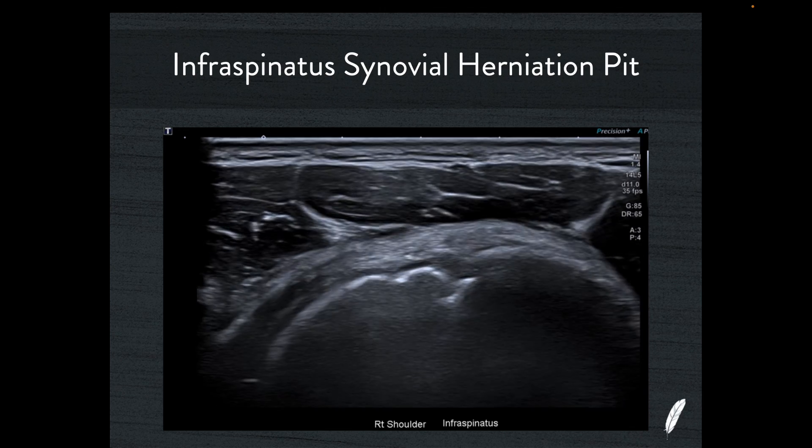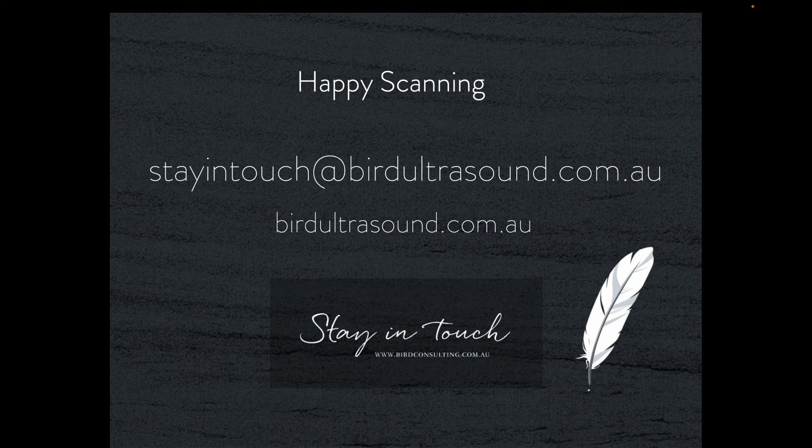It's nothing to be concerned about. I hope you now feel confident that you can tell the difference between a synovial herniation pit and a partial thickness articular surface tear of any of these rotator cuff tendons. It is a great piece of knowledge to have to prevent the classic MSK ultrasound mistake of making a false positive diagnosis in a patient that simply has a normal anatomical synovial herniation pit. If you're interested in a more detailed look at all the other little chinks in the bone — from erosions from gout, rheumatoid, osteoarthritis changes, enthesopathic changes, etc. — please visit birdultrasound.com.au for the full length version. Happy scanning and bye for now.